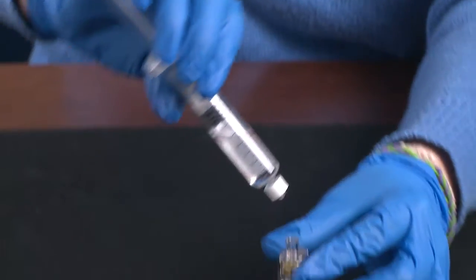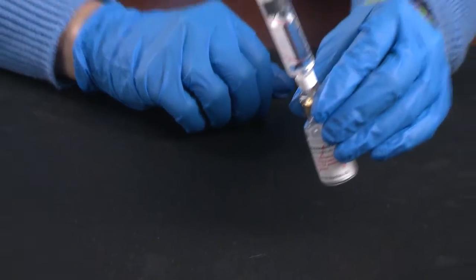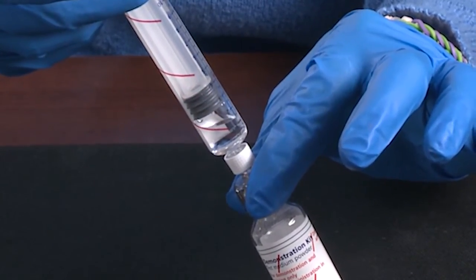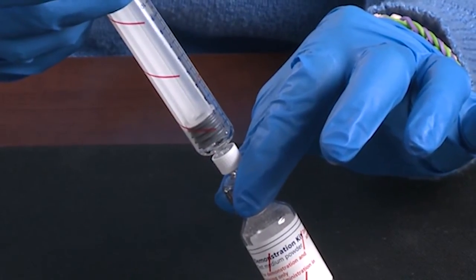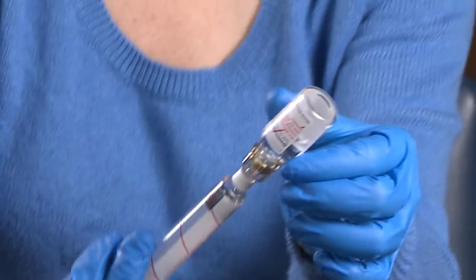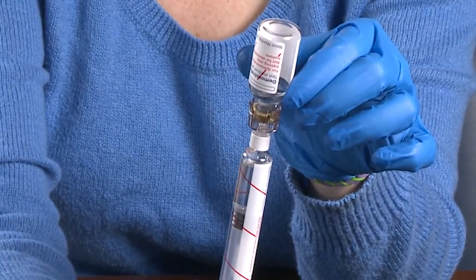Screw the pre-filled syringe onto the vial adapter. Hold the pre-filled syringe slightly tilted and push the plunger so that all the liquid goes into the vial. Keep the plunger pressed in and gently swirl. When the liquid is mixed, turn the syringe over so the vial is on top and gently pull the plunger down to withdraw the factor from the vial.